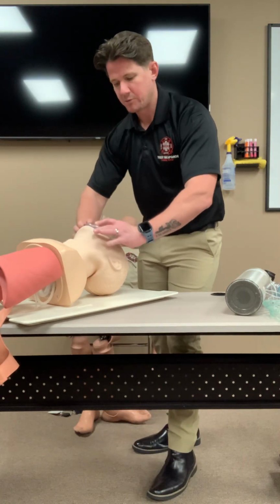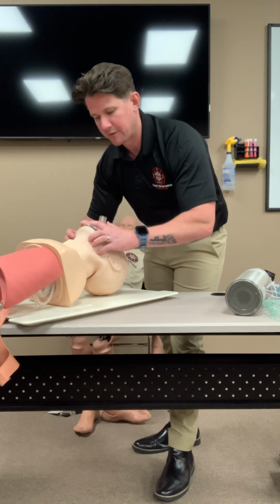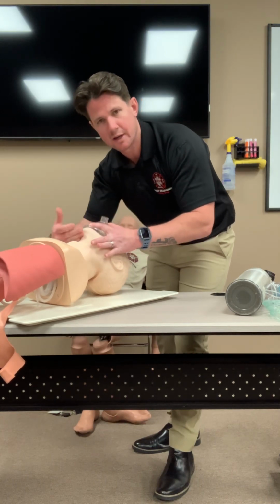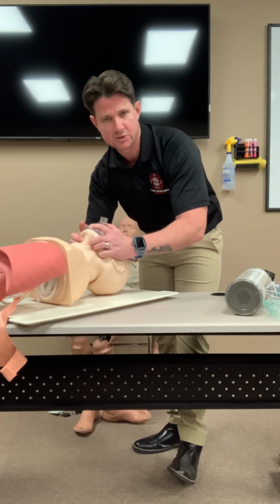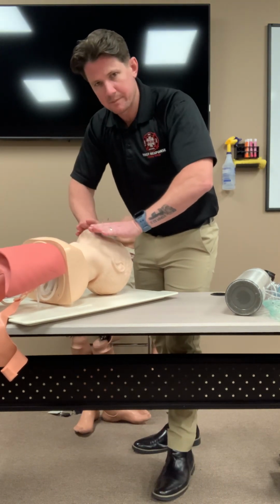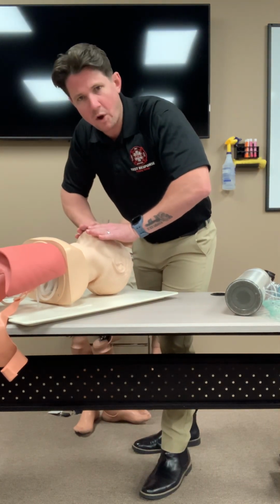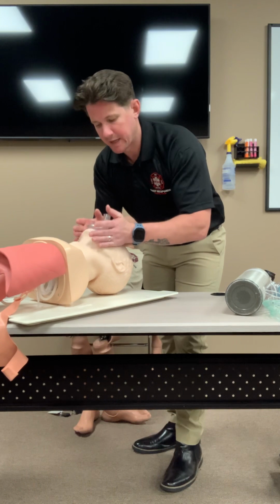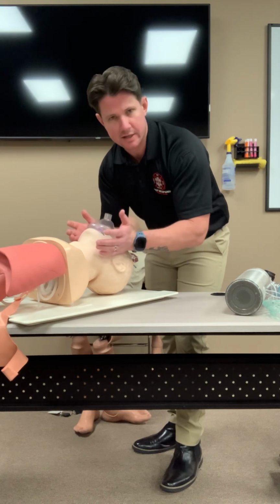But number 2, if I'm using a double CE, there's 2 complications that I run the risk of doing, especially if I'm not as strong of a person. If I'm pulling up on the jaw and I'm really digging in with these 3 fingers, all of this here is soft tissue. If I push too hard, I'm going to push the tissue and occlude the glottic opening a little bit, potentially. Secondly, when I'm pushing this way, like I'm doing a push-up, this is very intuitive. I have a lot of leverage here, and naturally I want to push into the patient's face, once again squishing their facial structures together. So again, the double CE is not wrong at all. It's a perfectly acceptable technique.